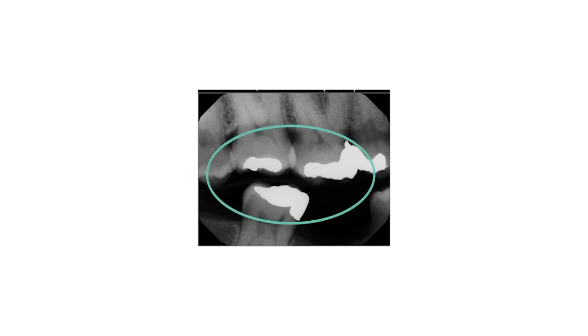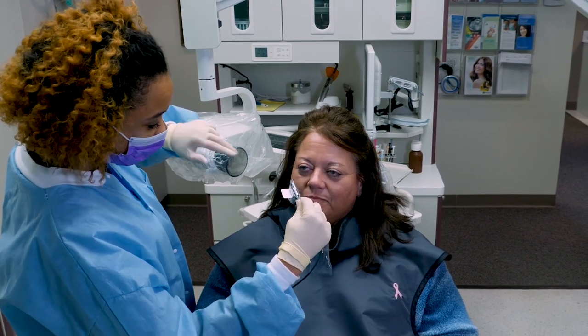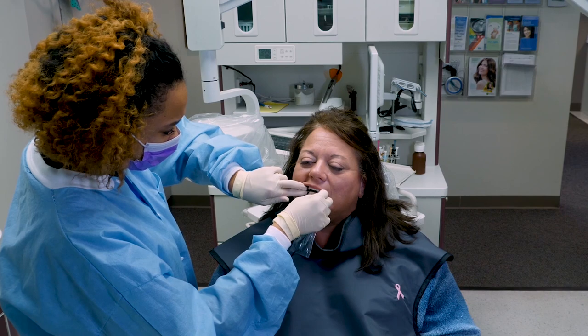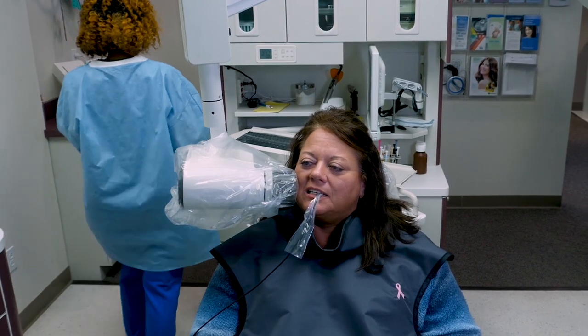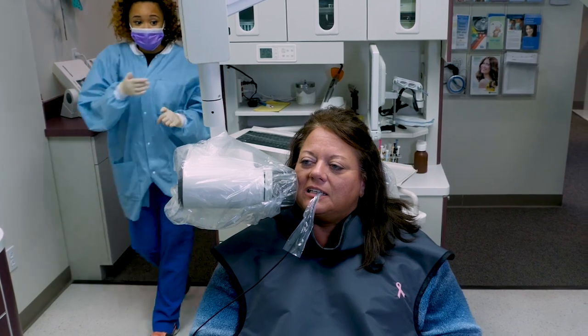Procedural steps for receptor placement and exposure of the molar area on the right side of the mouth include: place the receptor with the bite tab in the patient's mouth on the right side, between the tongue and the teeth in the molar area. Instruct the patient to bite down on the bite tab. Position the tube head at a plus 10 angulation and perpendicular to the teeth and expose the receptor.